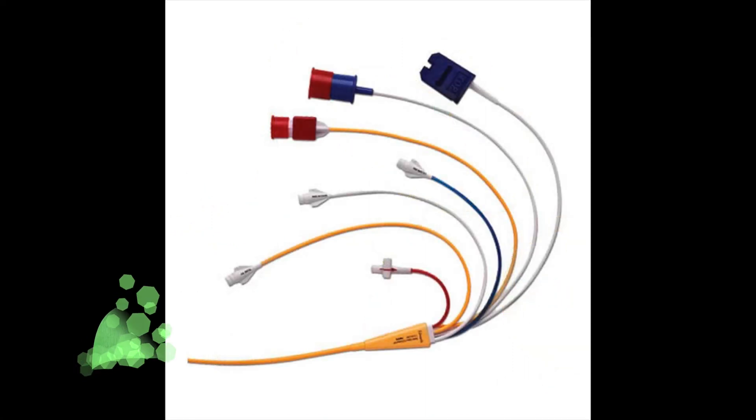The yellow port is the distal port. It is positioned in the pulmonary artery and attached to a pressure line, and measures pulmonary artery pressure and pulmonary capillary wedge pressure.